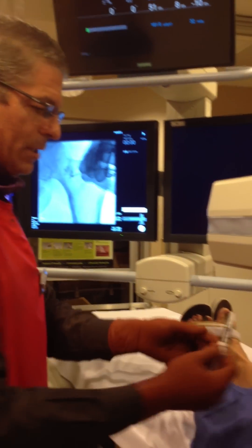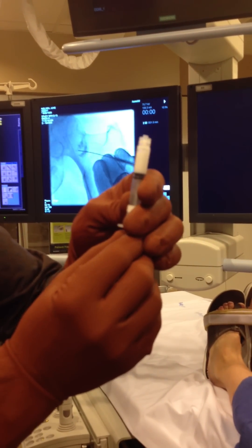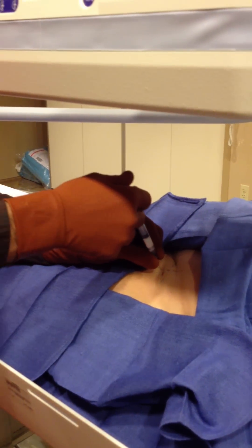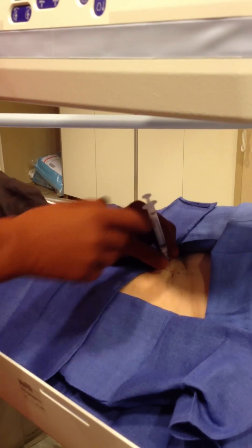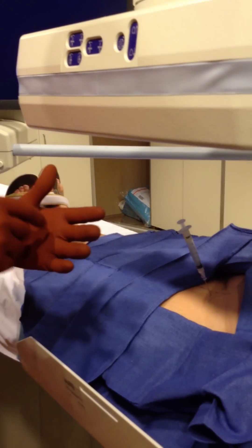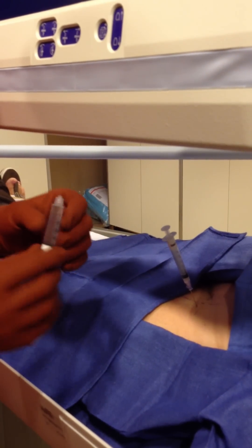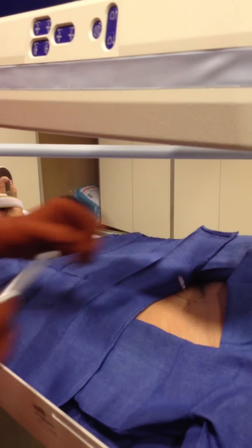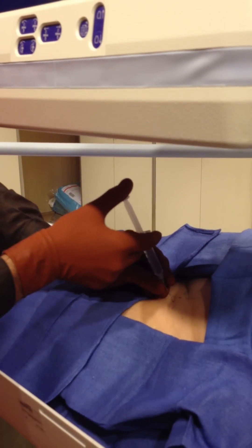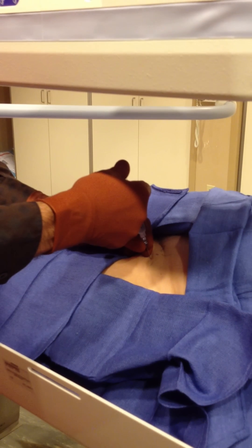After that, get your medicine. We use Depomedrol — 40 milligrams. Some other places use Kenalog. Always put the Depomedrol in first, mixed to 1 cc. Sometimes if you have the needle all the way up against the bone, it's very hard to inject because once you take the stylet out of the needle, the needle tip is flat and you can basically obstruct the tip. So just back it off just a touch. After the Depomedrol goes in, we put in Sensorcaine or Marcaine — a long-acting anesthetic, anywhere from three to five cc's. Always put the Depomedrol in first, followed by the Sensorcaine.